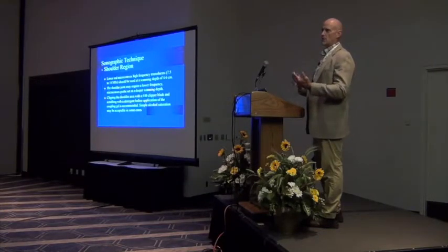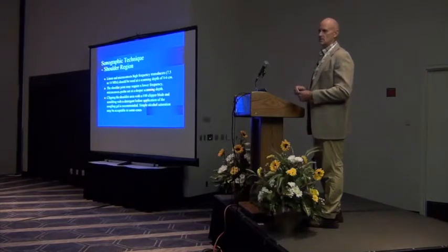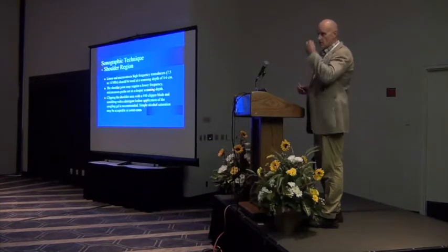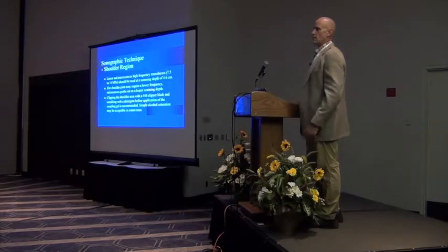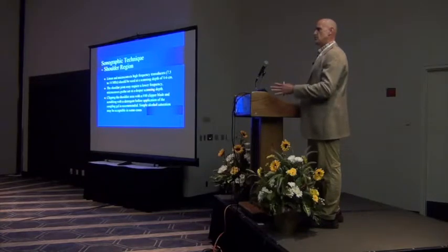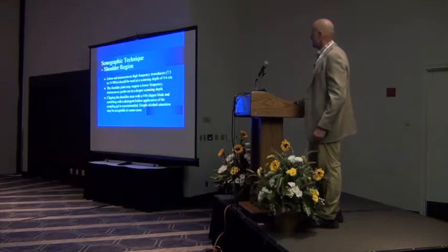If y'all haven't heard, most of us are using ultrasound to make sure we know where we're at. And a lot of times it's in tendon or ligament injuries, and we want to guide our injections to get to these structures where we need them to be. So I think there's any number of ways you can make a living with ultrasound. But not only that, you're doing it the right way. So I don't think you're just padding your pocket. You're treating this case as appropriately as possible.